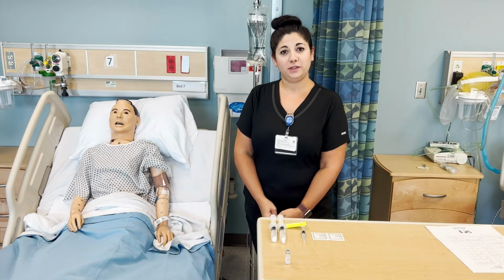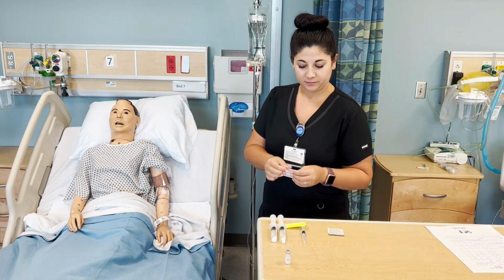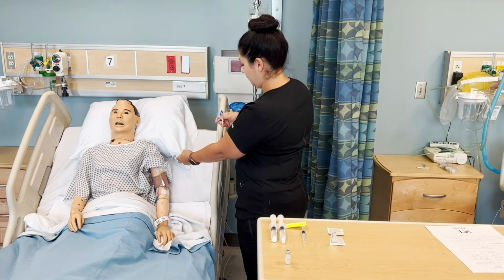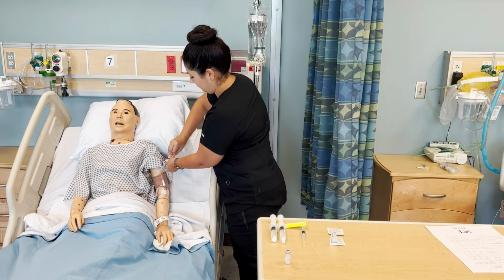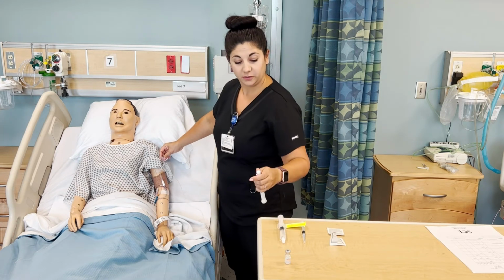I will now show you what to do if your primary fluids are incompatible with your medication. First, you will clean the site closest to the patient after fully clamping your primary fluids, for at least 15 seconds vigorously. Keeping a hold on that so you don't lose sterility.